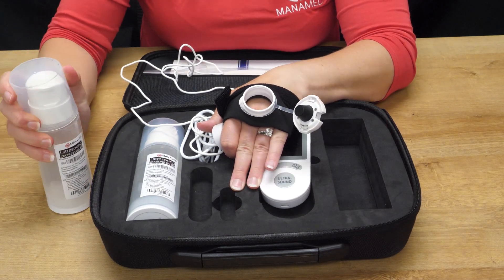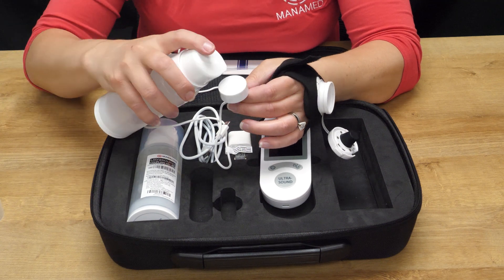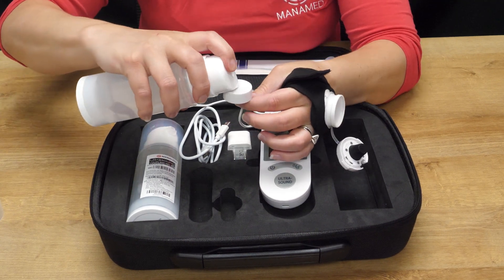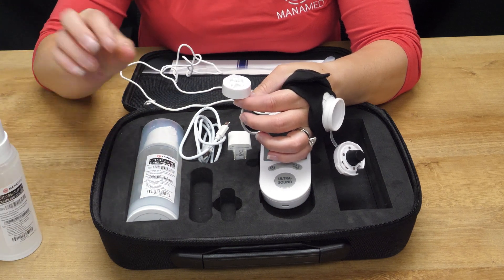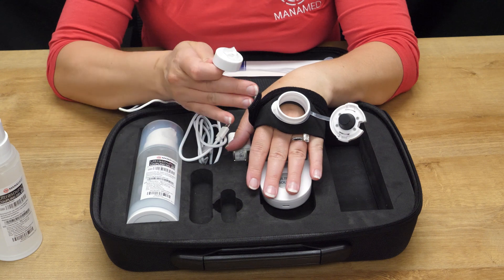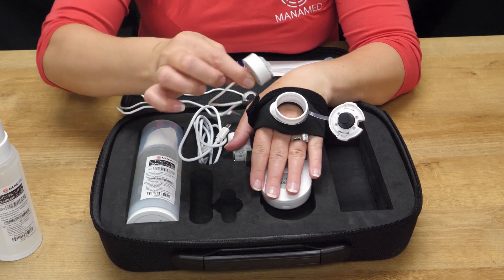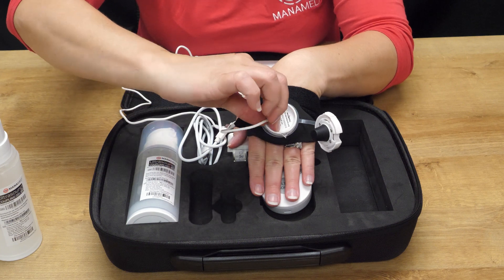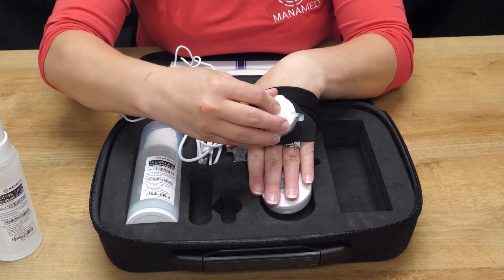The ultrasound gel is ready to use. You'll take it and put it opposite the cord — put two pumps on there. You want enough gel that the unit works, but not so much that it's everywhere. You'll take the transducer gel side to skin and place it inside. You should feel the contact on your skin, and then you'll shut the unit.